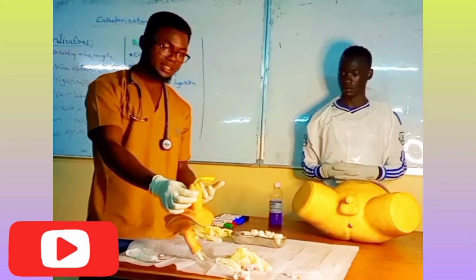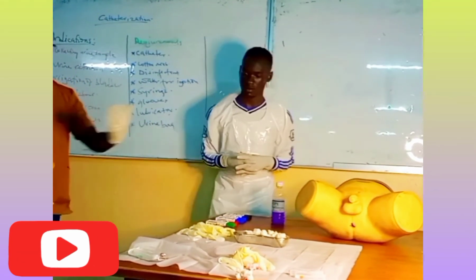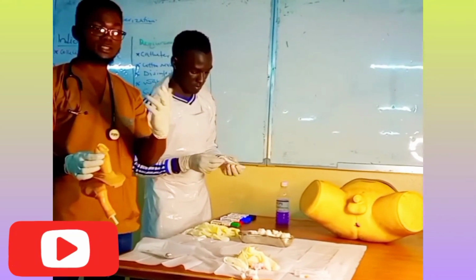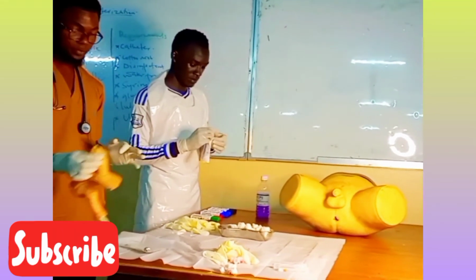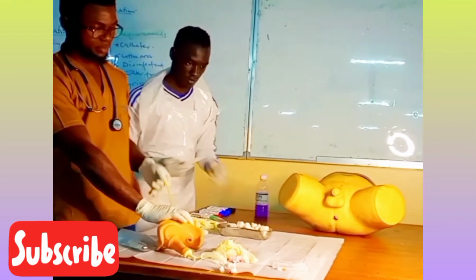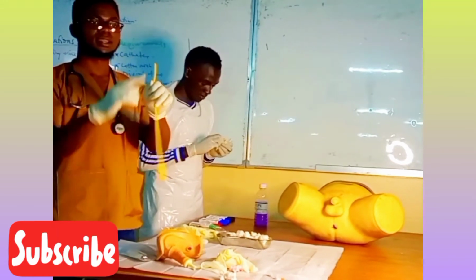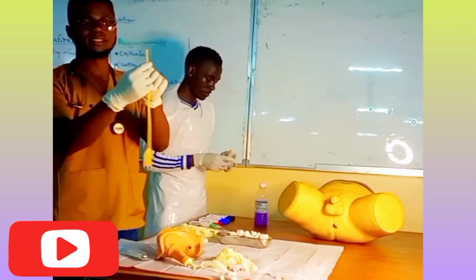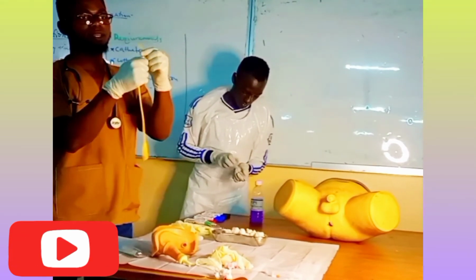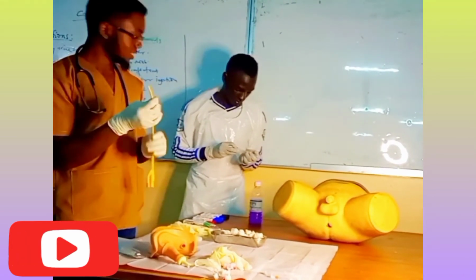So at this point, I'm going to balloon. So my assistant is going to put our water in this syringe. We balloon with normally 20 milliliters of water for injection to 30 milliliters water for injection. So what is the science behind ballooning? When you look at this catheter, this part is going to enter the bladder. It has openings. Then below it, we have a sac-like thing. You can feel it. It is the balloon.